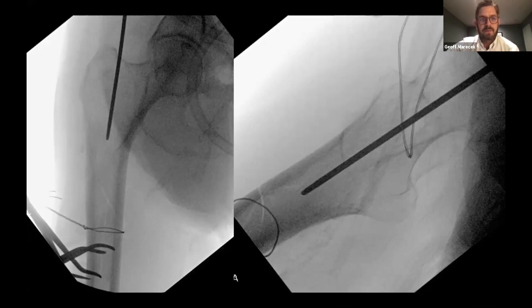And then, a couple things on implant selection here. I would venture that in a fracture at this level of the diaphysis, you could choose any sort of proximal fixation you want, but in a 90-year-old, you want fixation into the head to protect the femoral neck. And so similar to Ed and Mitch, I strongly prefer to be in line with the canal. I think everybody's proximal femoral geometry is unique. So one person's head-neck trochanter relationship and a different person's head-neck trochanter relationship will be different. And every nail is different.